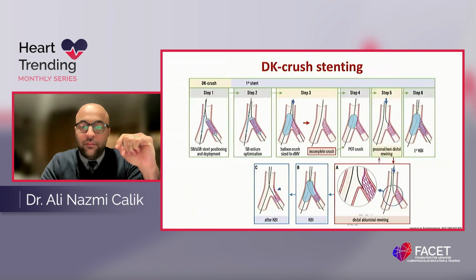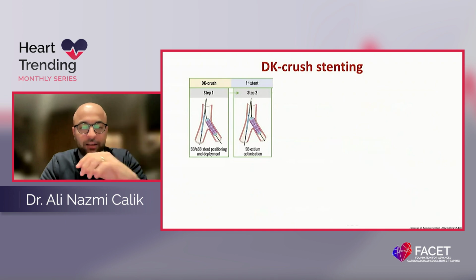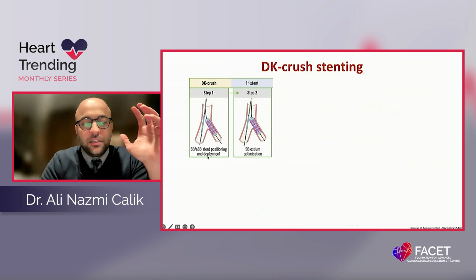So when I go through the steps, I will not bother you. I will fragment it. I will dissect it for you. The first step is parking a balloon in the main vessel, then advancing the side branch stent and deploying.